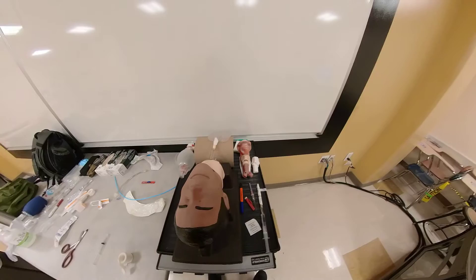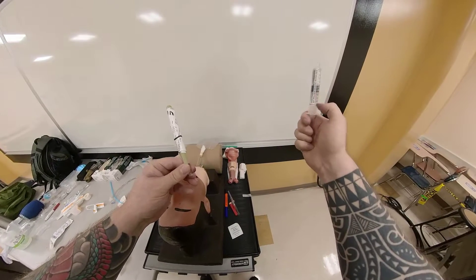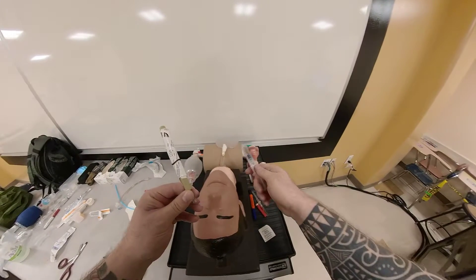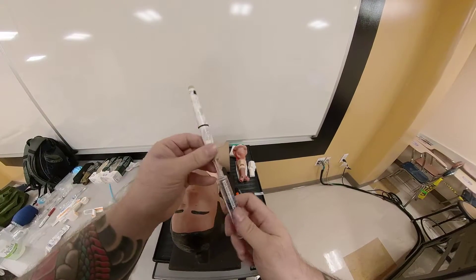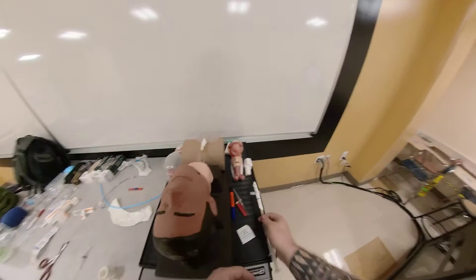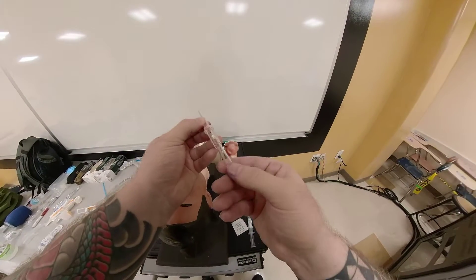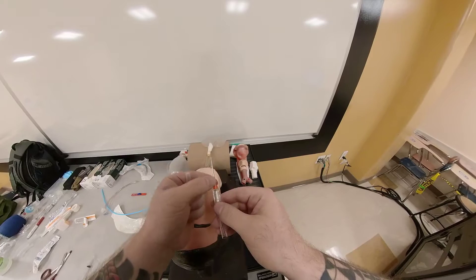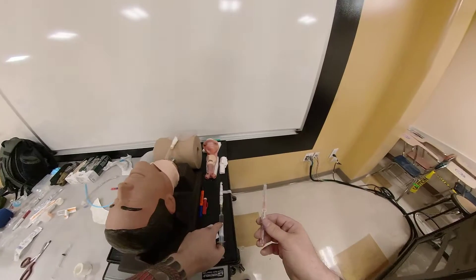What equipment are you going to need? You're going to need a 10-cc syringe with saline — essentially a saline lock. I want saline in it, and I expel about five cc of it so that I get air bubbles, so I know I'm in the correct location as I penetrate through soft tissues and once I get to the trachea, I'll have ease of advancement of the plunger and air bubbles. I'm using a 14-gauge catheter — this needle is a 3.25 inch, used for needle decompression of the chest. I'm using it because I can thread my syringe over this catheter. If you're going to do this procedure, you want a length that will not be too long, and you want to be able to connect the syringe to it.